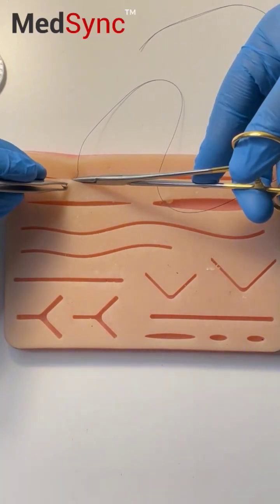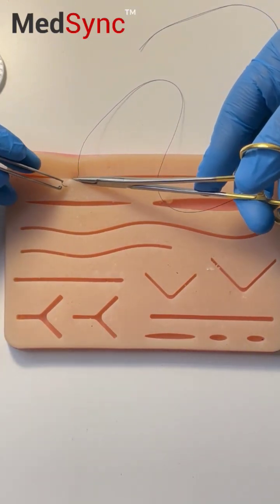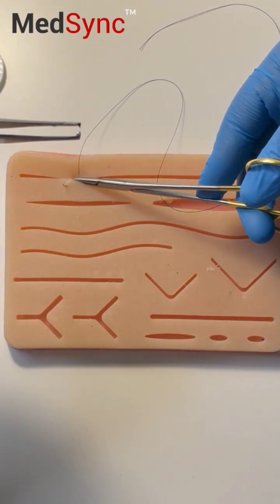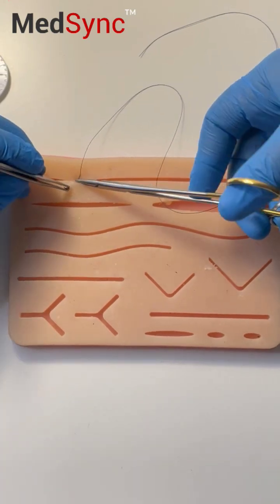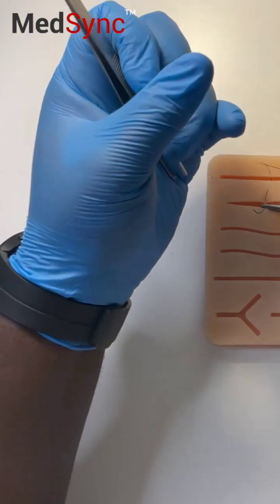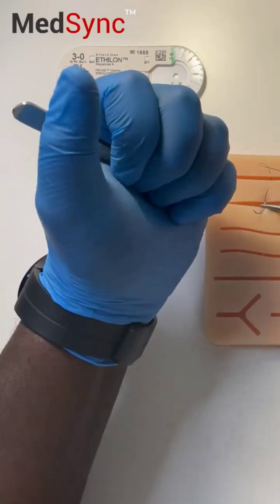Rotate your wrist. Mount the needle between the teeth of the forceps. Mount it straight away and palm your forceps right here.